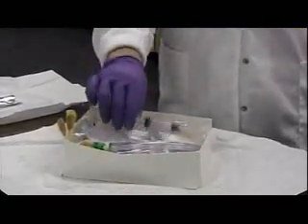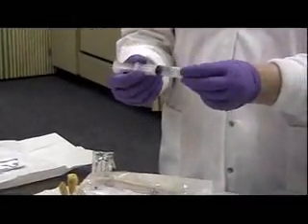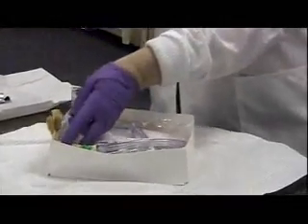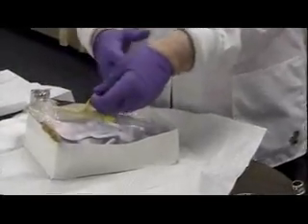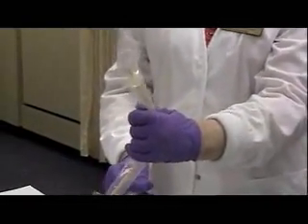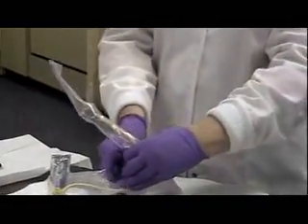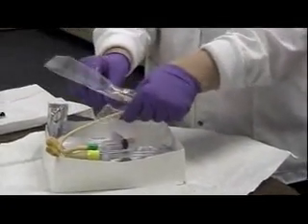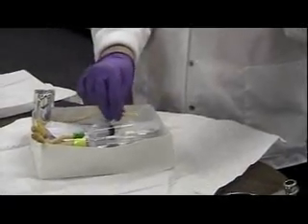The next step is to check the bulb on the catheter to make sure it is patent and intact. Take the syringe of water, remove the tip, and insert it into the port of the catheter, then inject the water to confirm the bulb is intact and holding water. Let back off the syringe and the water returns into it. Then carefully inch the catheter out of the plastic slowly, making sure it does not flop over the outside of the box, which would contaminate it.